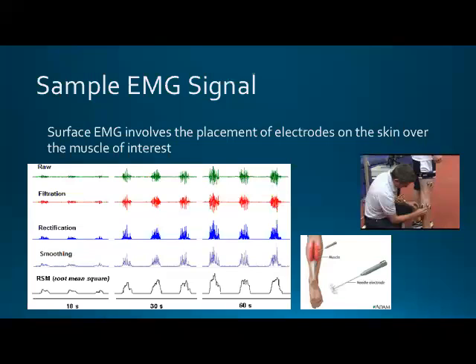But let's think about like the sensitivity of the different measures. So you have a needle that's going right into the skin, right into the muscle belly, versus something that's just sitting over the skin. More, I guess, bursts in the direct measurement. So if talking about like quantity, you're going to probably get more muscle fibers that fall within the surface signal, right, where those sensors are, rather than the intramuscular. So the intramuscular is going to be more precise.